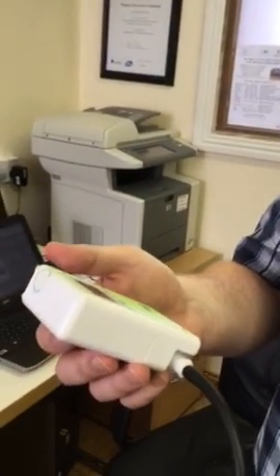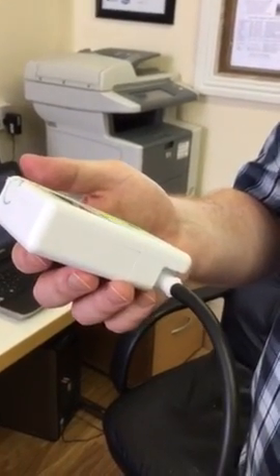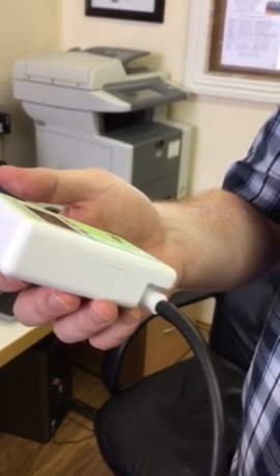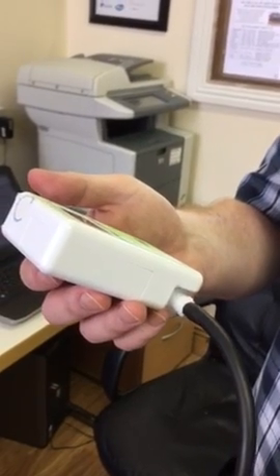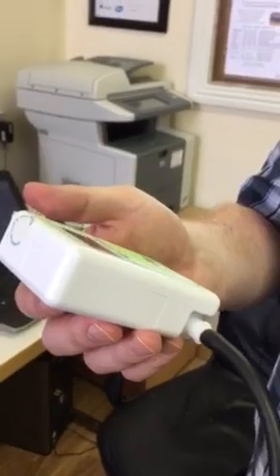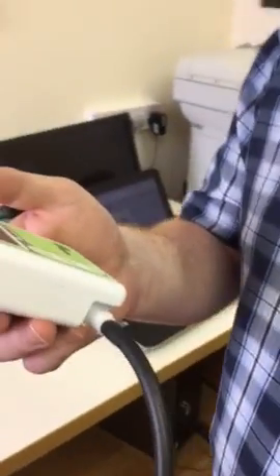But I'll just hold it and make sure that it gives a proper reading. And indeed it does.